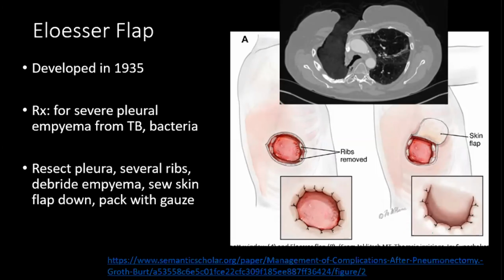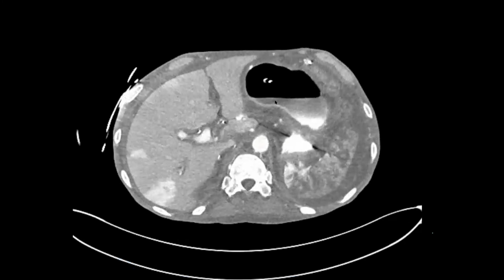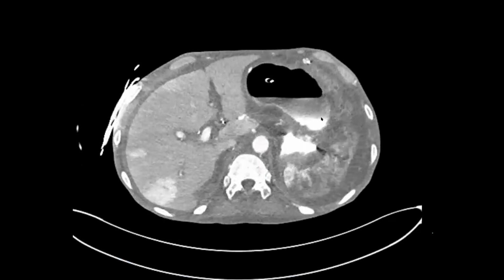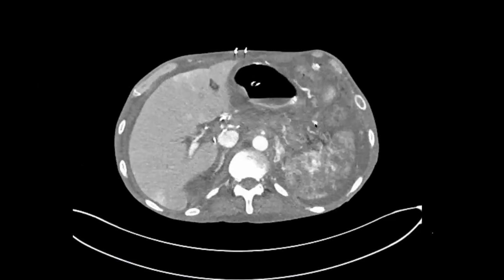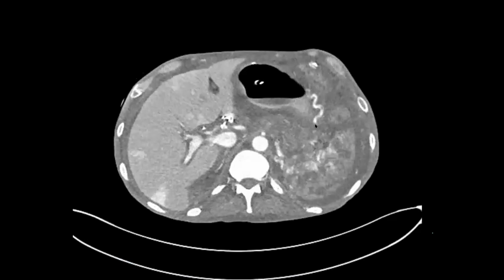Okay, my next case is this one. This is a case that my resident fellow Hernan showed me. So Patty might have seen this one also. I don't know why it's not scrolling. Okay, here. This patient has had a liver transplant. And they have some unusual connections to their liver transplant. So focus on the portal vein.